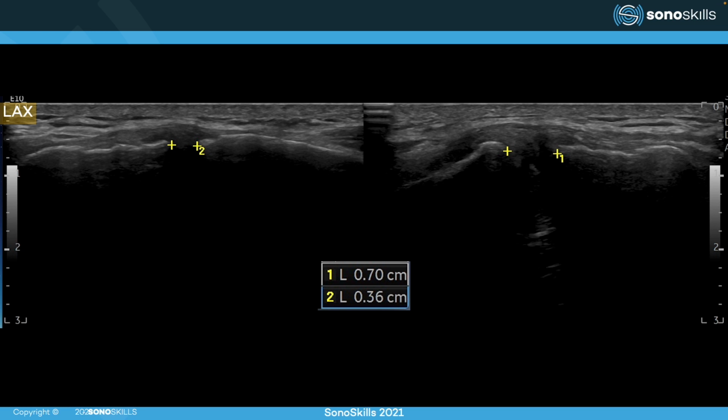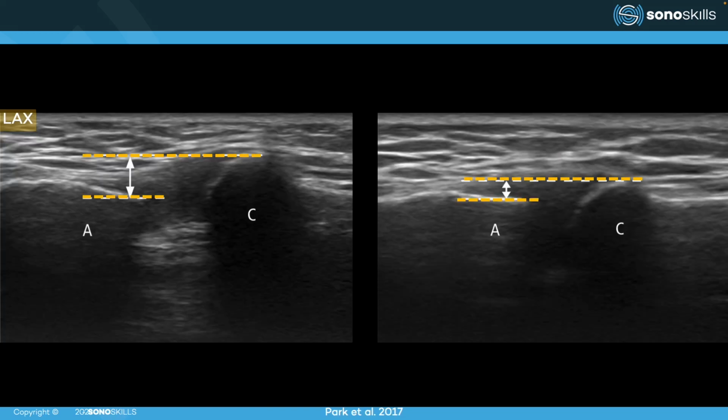So a few pathology slides, and then it's back to you, Aran. In the left image, we see a normal AC joint. In the right image, we can see an instability during this crossover sign, and measuring the biggest gap. And you can see a clear difference between both sides, indicating a ligamentous problem of the AC joint. And it's not only about widening, but also the height of the joint. We can see that the clavicle on the left is much higher than the clavicle on the right side, also leading to instability. And this is also easy to see during these dynamic movements.